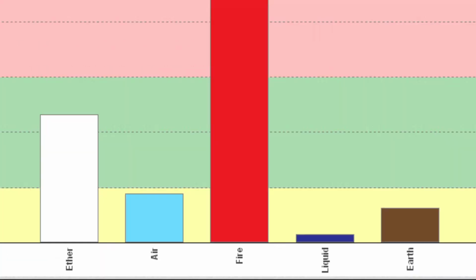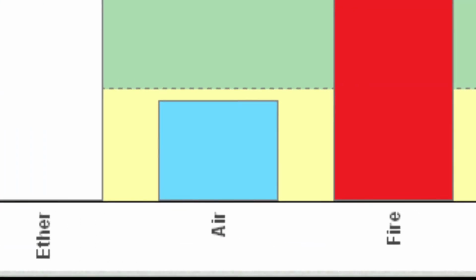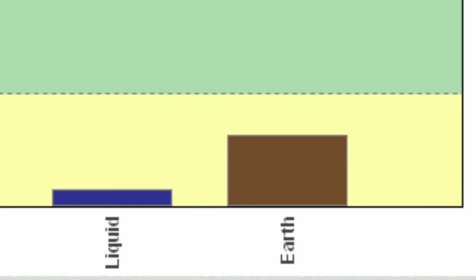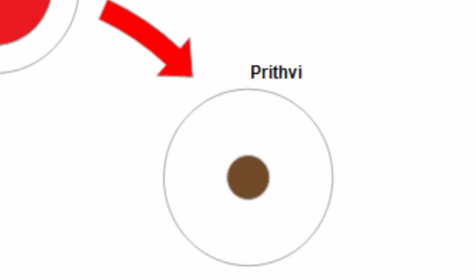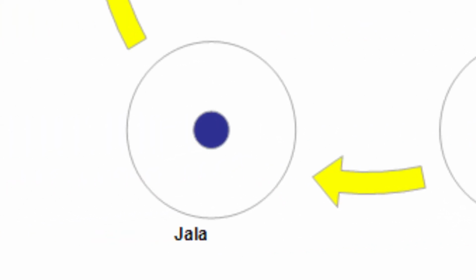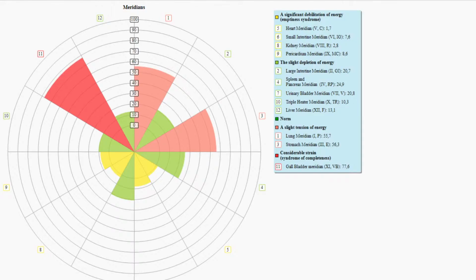There is also the Pancha Mahabhuta tab, which means 5 elements, and allows evaluating the elements' syndromes, the signs appearing just before the course of disease. It is very important to know the signs to prevent disease and for a subtle understanding of the roots of the disease.